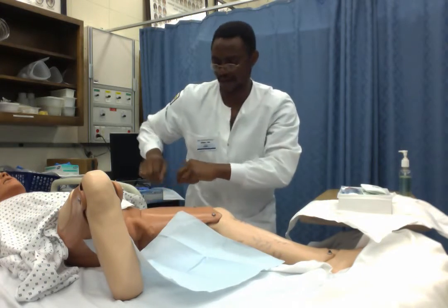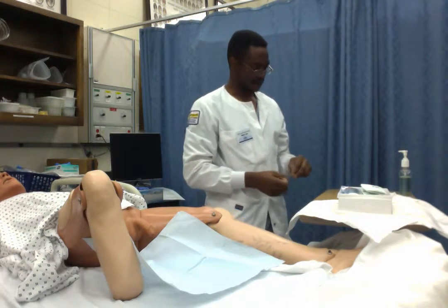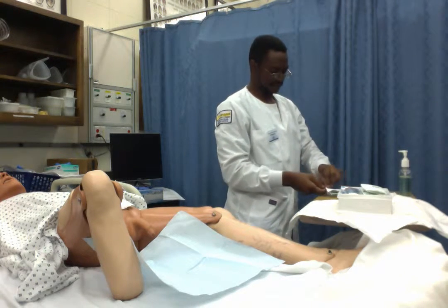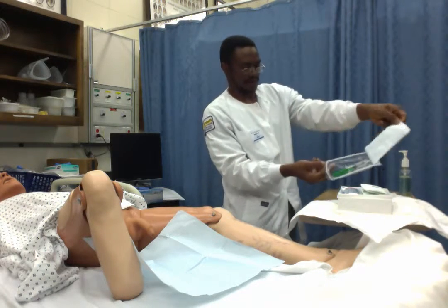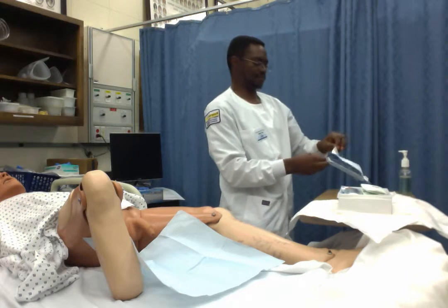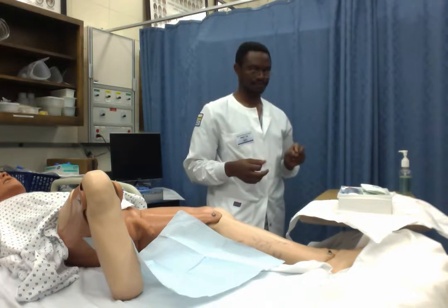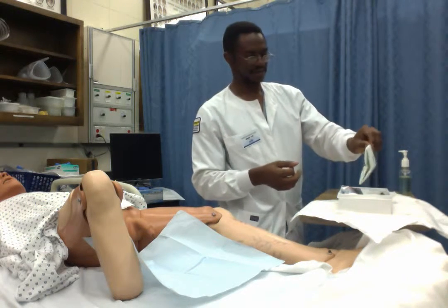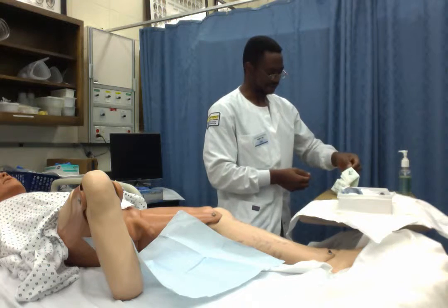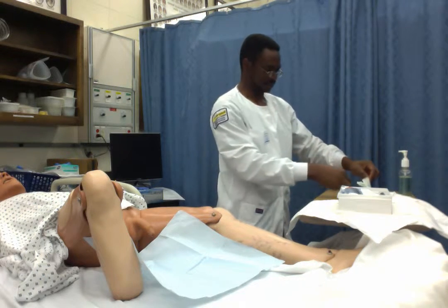And then you always want to make sure you hang the drainage bag on the bed right below the bladder. And now I will don my sterile gloves. According to hospital policy, you'll attach it to the patient's inner thigh.